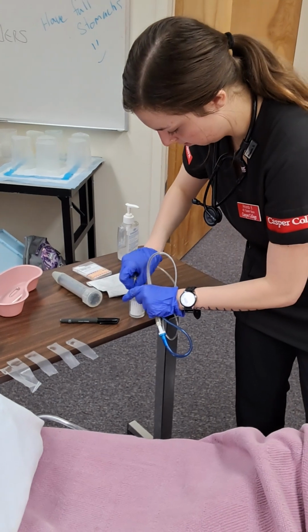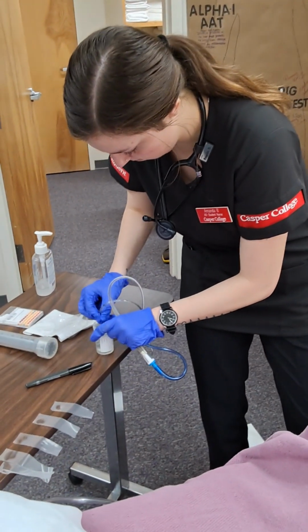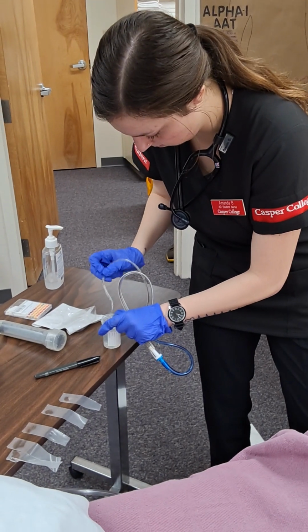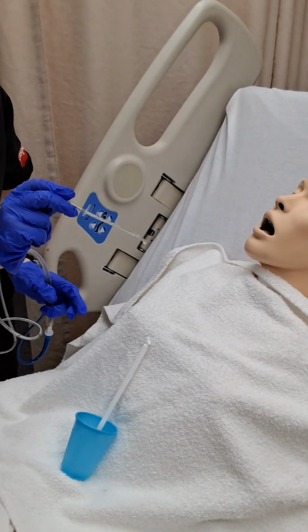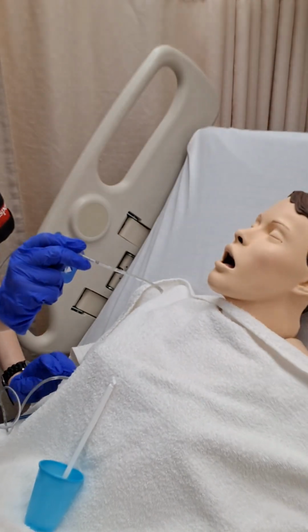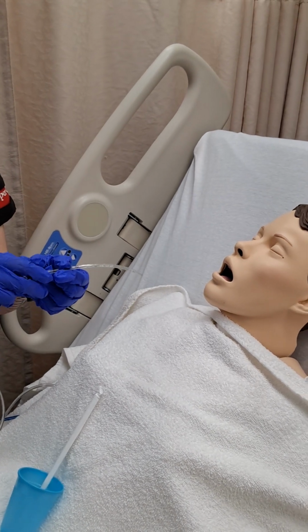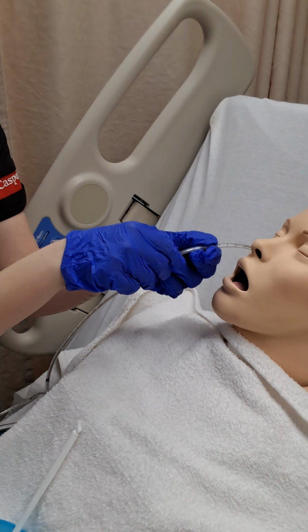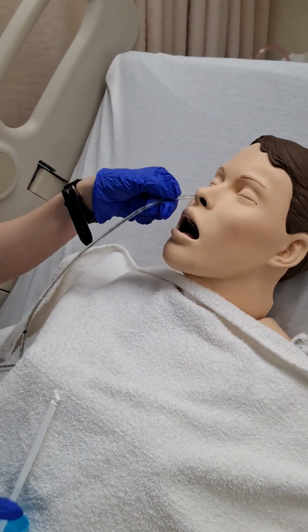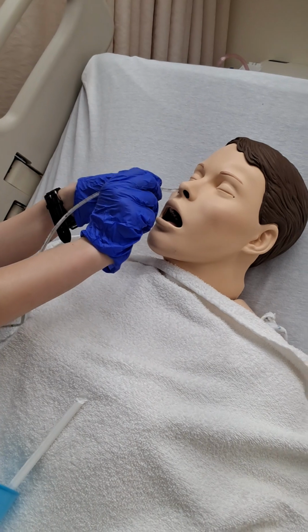Going to lubricate the tubing. Okay. Like I said, if you feel pain and if you're having difficulty breathing, raise your left hand and let me know. Are you ready? Yeah? Okay. 1, 2, 3. I'm ensuring that's not kinked. Okay, now you can lean your head forward and sip from the straw.